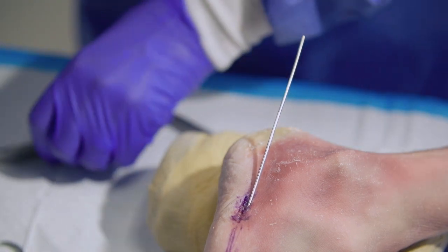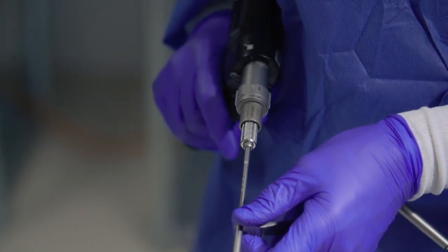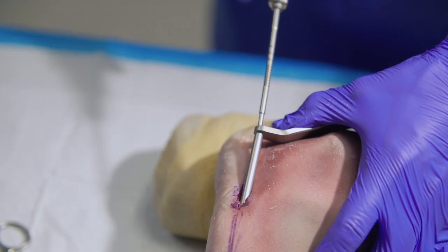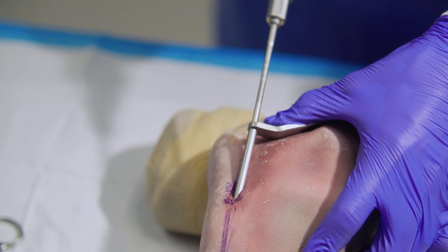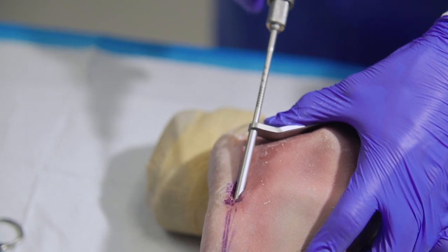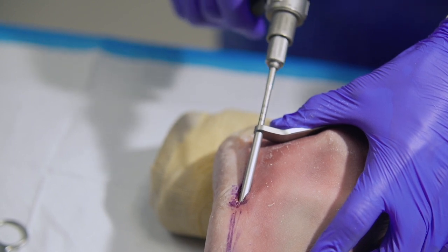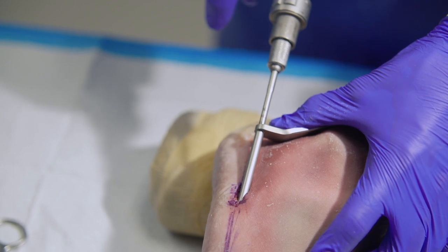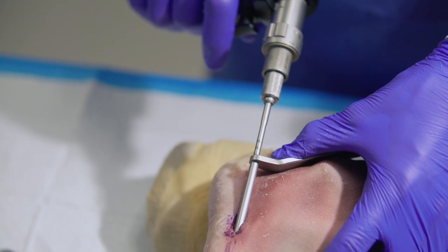Next, we'll utilize the cannulated drill with soft tissue sleeve, and we'll use this to enter into the medullary canal, making sure that we go past the fracture. The drill itself is calibrated and can be read off of the drill sleeve, giving you multiple options to ensure proper length and proper screw placement and selection.